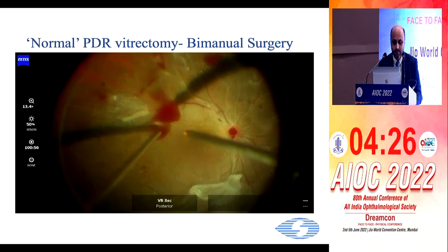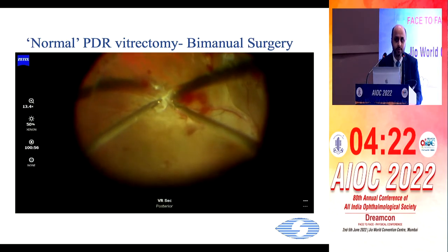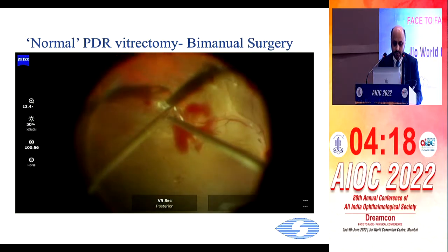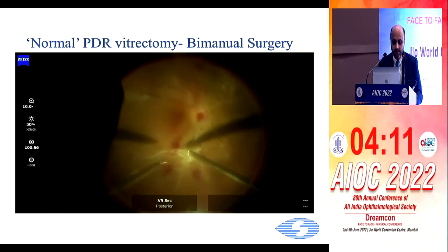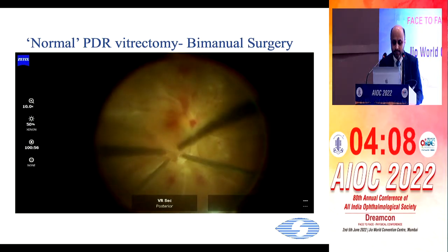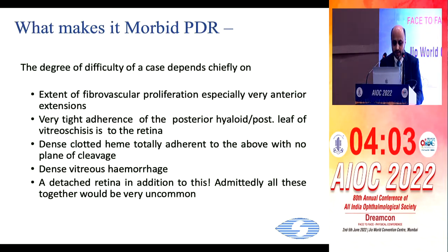This is again a technique of bimanually taking the flute needle and a cautery in one hand, and bimanually managing all the bleeders. And then finally, we dissected the superior membrane. And thankfully, there was no tamponade being used in this case ultimately.